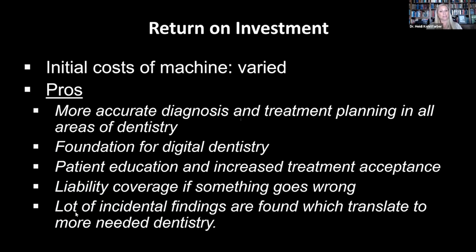All right, a lot of information. Just a few more slides to talk about return on investment. So we're trying to get through it all. It was a huge Herculean task for today.